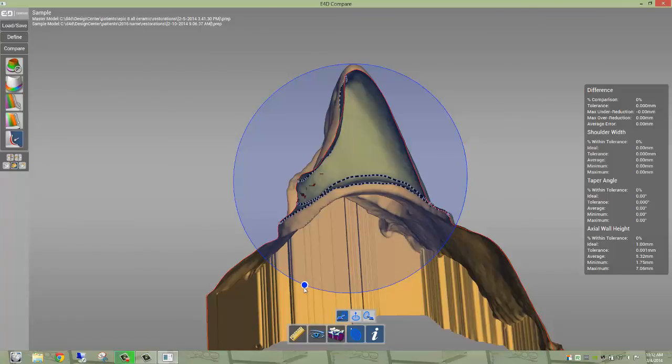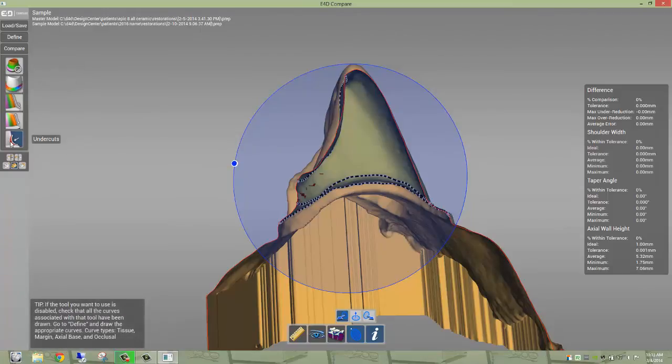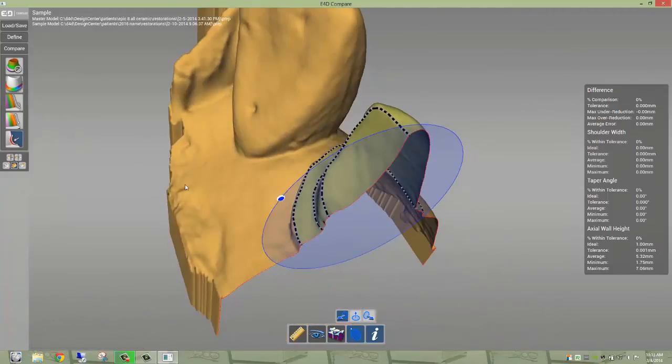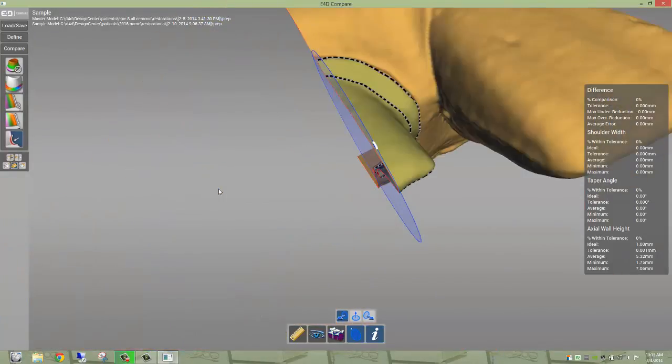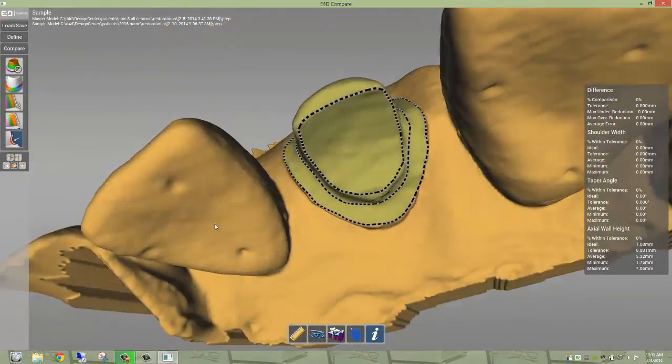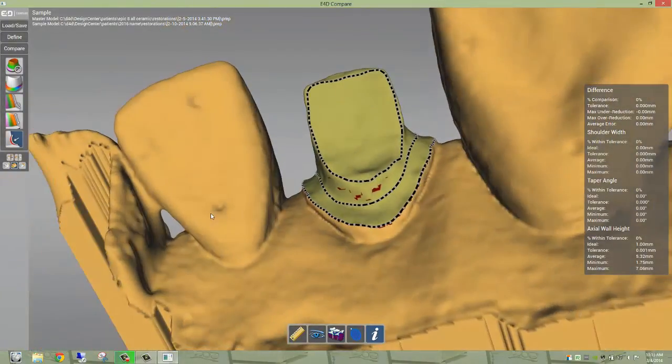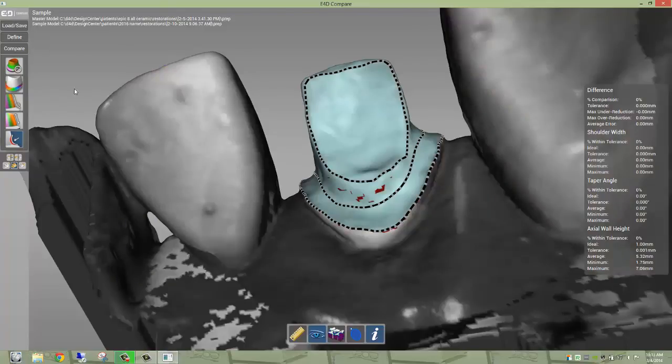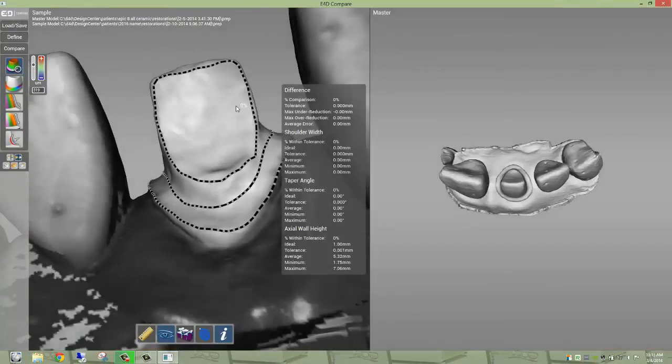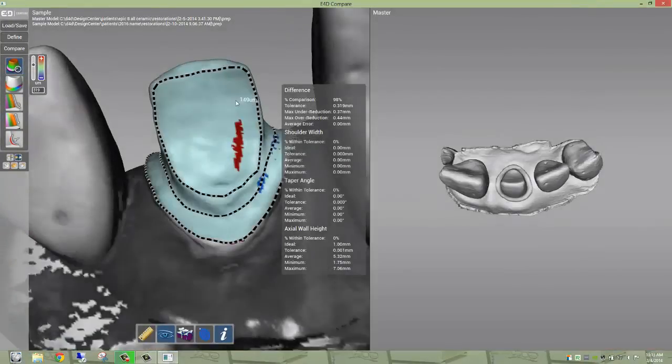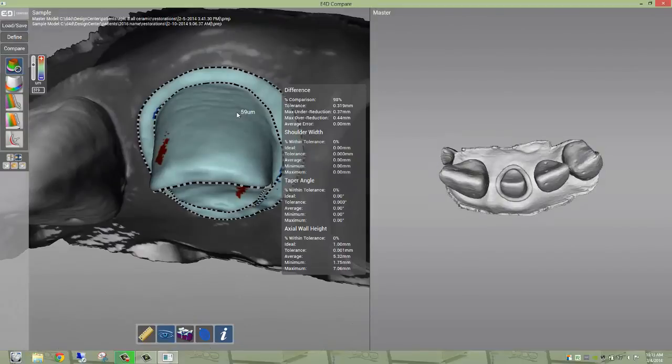And so that's basically what we do here. We utilize mainly the compute difference, the shoulder width, and the undercut gauge. Students typically take between three to five minutes to evaluate their preparation from start to finish. That includes scanning time, which typically takes under a minute. And we feel like this has transformed the way that we evaluate preparations and feel that it's the future of assessment, not only self-assessment, but also as a tool to allow faculty to objectively assign a grade to student preparation.